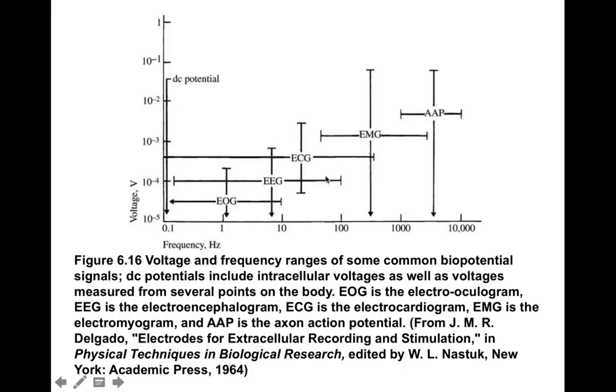frequency range of the EEG, the ECG, and the EMG. So for all three of the biopotentials that we're typically concerned about, there's a 60 hertz part of the signal spectrum as well. So trying to filter out the 60 hertz noise, the bottom line is that it can impact the measurement you actually make.